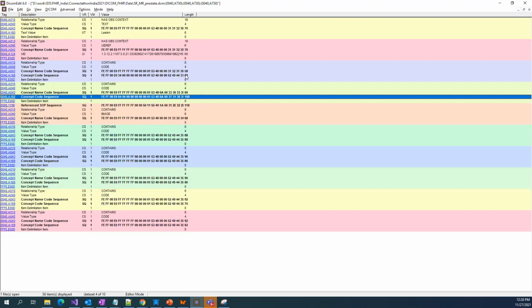So what are we going to do? We are going to parse this DICOM SR and find this information. But isn't that easy? Why are we even doing a Connectathon on this one? The whole purpose is how do you encode? This is the standard. It is following this TID 1500 format. Whatever Siemens is generating, Philips should be able to read that. That is possible only if you are following the standard, which is the TID 1500 structured report template format. And if you write like this, anybody should be able to read it.